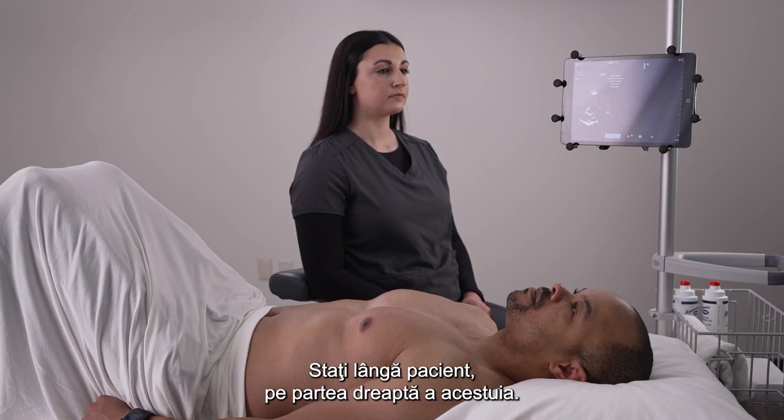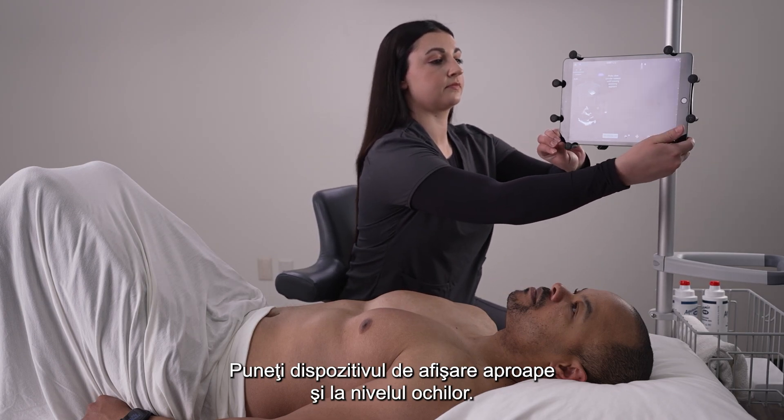Sit next to the patient on the right side. Place your display device within reach and at eye level.